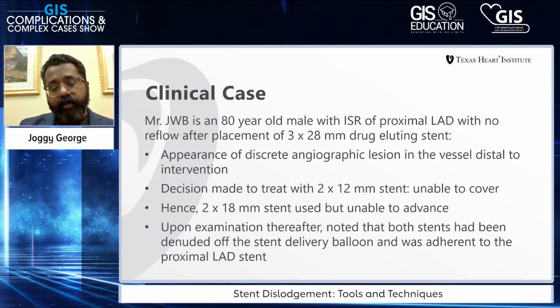And then upon looking at the angiograms and looking at non-contrast images of the intervened area, it was demonstrated that both stents, both the 2 by 12 millimeter stent as well as the 2 by 18 millimeter stent, were adherent to the previously placed LAD stent.